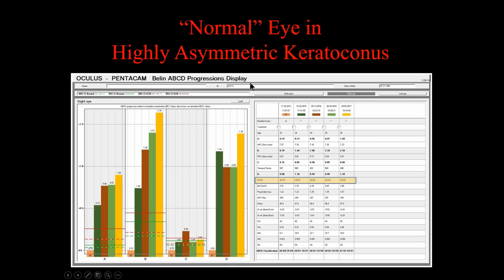So they decided, and they followed this patient in 2013, 2015, 2016, later in 2016, and then in 2017. And if you look here, the vision was 20/15. Here, for one time, it went to 20/22, but then back to 20/20, 20/20. And then the patient came in 2017 saying, okay, now I actually notice a change in my vision. And they opted to treat in 2017.